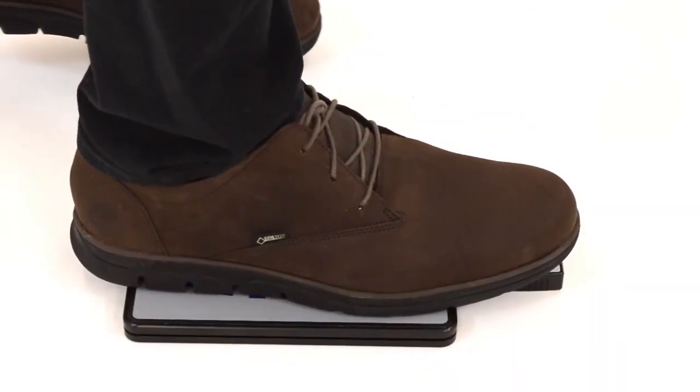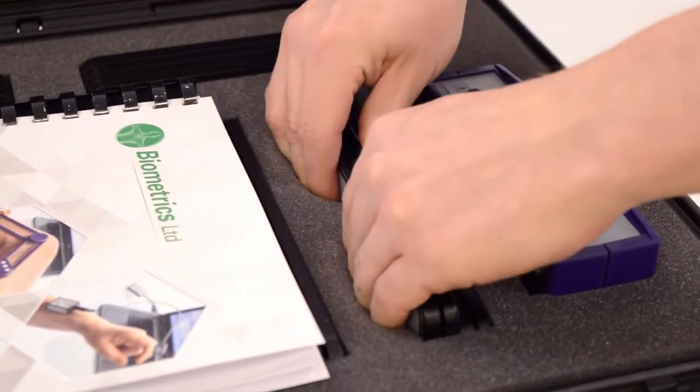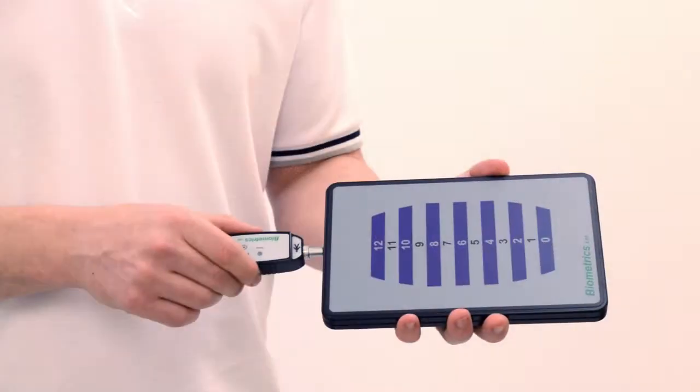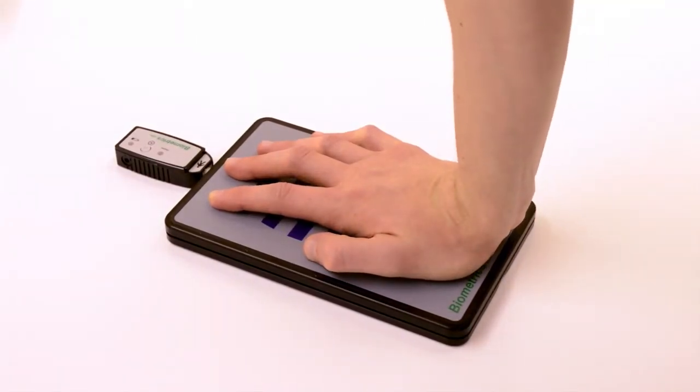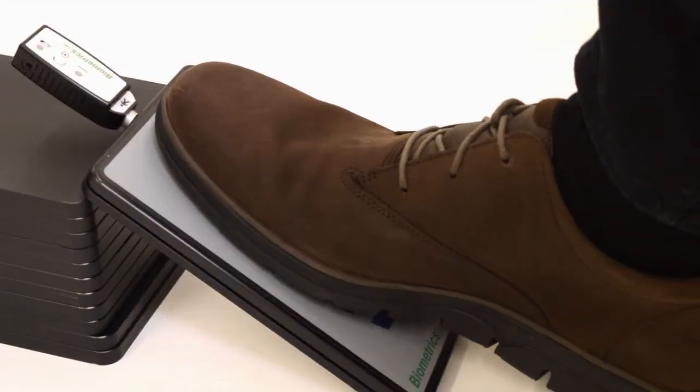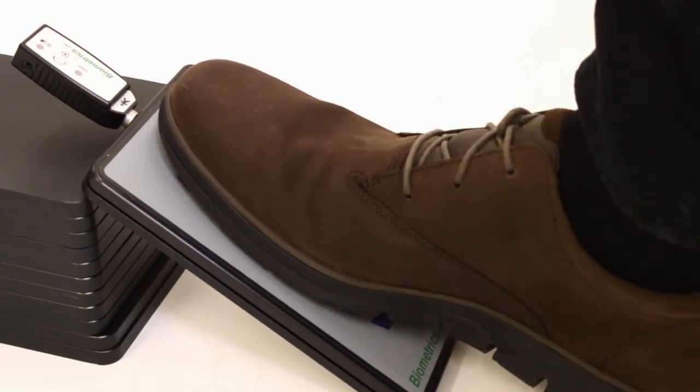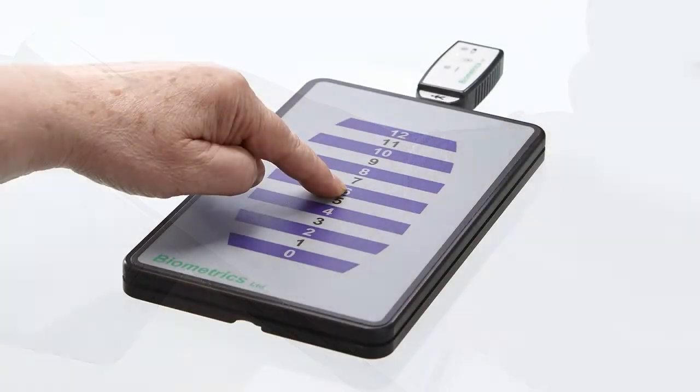The e-link force plate is portable and easily positioned for upper extremity weight bearing for the hand, arm, and shoulder, standing balance, seated balance, and isometric ankle dorsiflexion or plantar flexion.